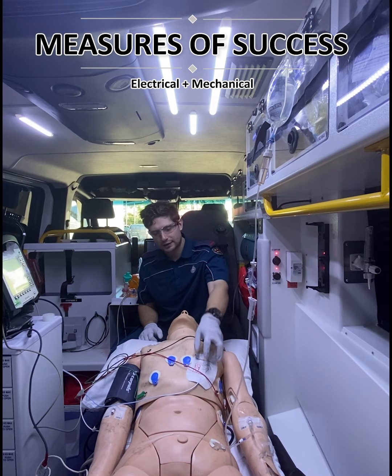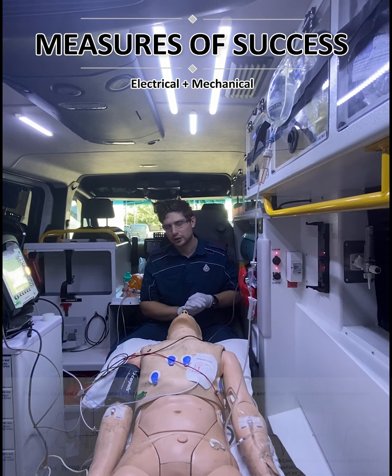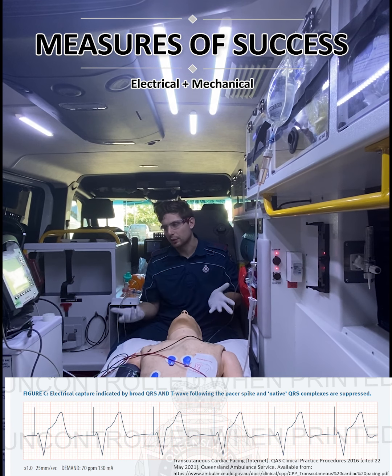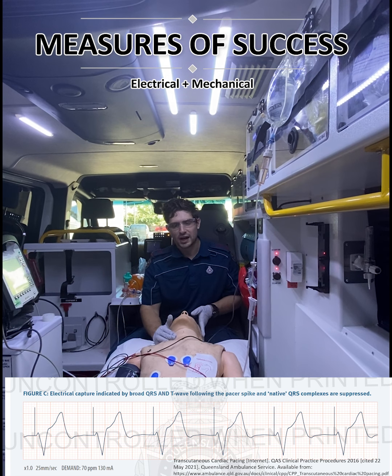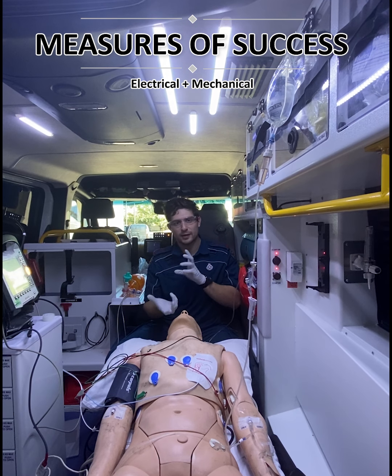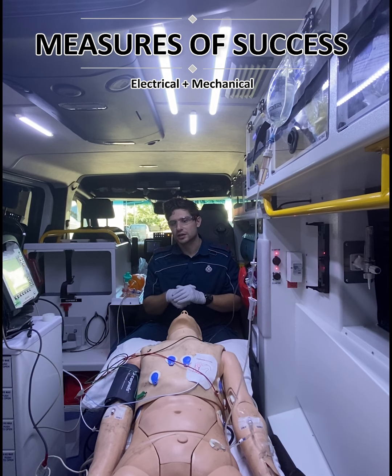So when we're looking at this pad placement, we're looking for 2 measures of success. The first one is electrical. We're looking for that pacing spike, QRS, and then T-wave. We also need the mechanical, however, because if we don't have a mechanical output, then there's no point to our procedure. We care more about the mechanics than we do probably the electricity. So that's a really important consideration.